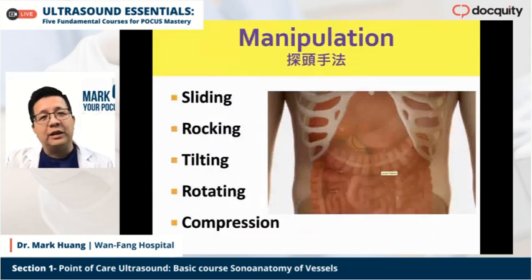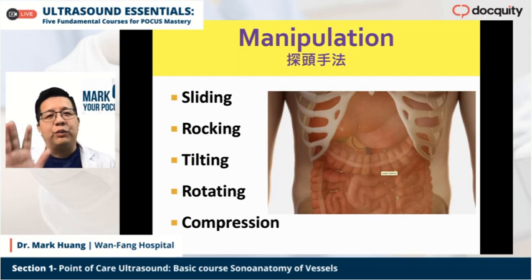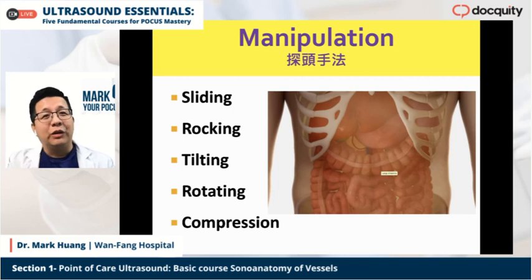Another important thing is manipulation. We have five manipulations, because in the future I hope you can practice in your clinical environment, so I need to teach you how to use it, not only read. You can see sliding, rocking, tilting, rotating and compression.